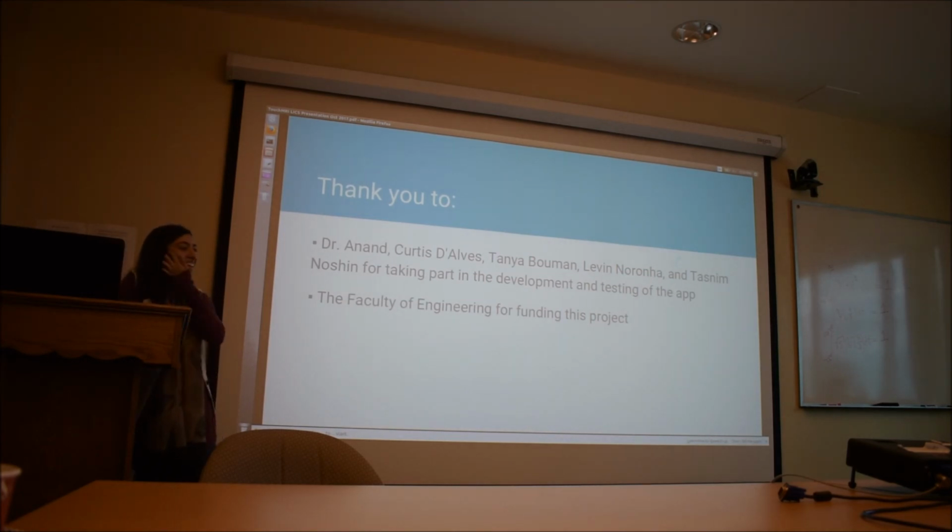Right. So those are different ways of sampling k-space. The actual MRI machines give you those options, and the doctors get to select from them. Do weird things happen depending on which way you pick? What kind of things happen? There are names for them, and I forgot what that name was. There are artifacts and aliasing. So if you know the way you're sampling k-space, you might know, if I get an image and there's something wrong with it, I should choose a different way.